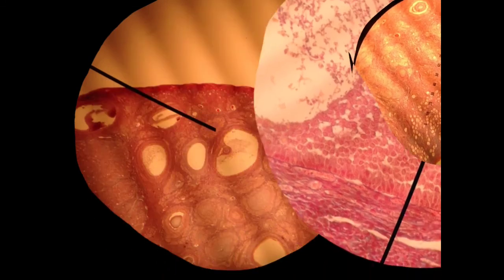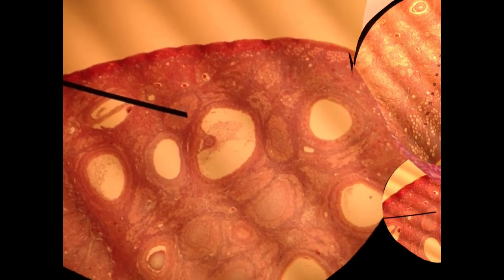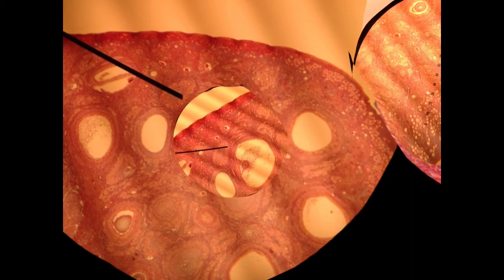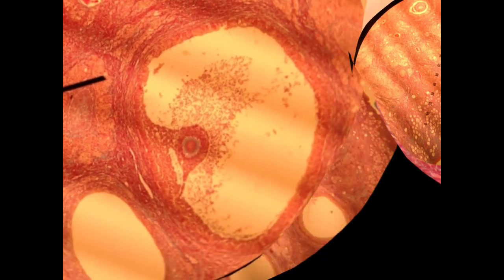Then there are also what are called theca cells, which are easiest to see in the tertiary follicle. Bring this one up. They are just outside of those granulosa cells. The granulosa cells are really the luminal cells lining the antrum, but the theca is this circular tissue right around the outside of the follicle. It almost looks like smooth muscle, but it's called theca, T-H-E-C-A. And that's pretty much it.